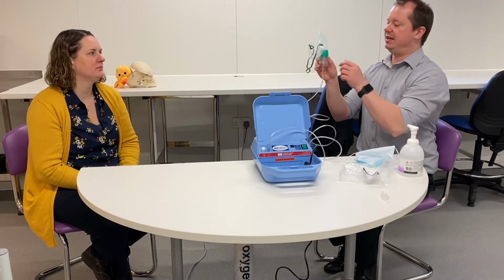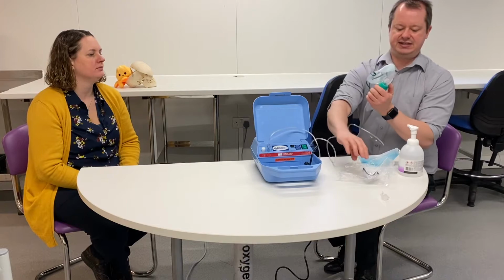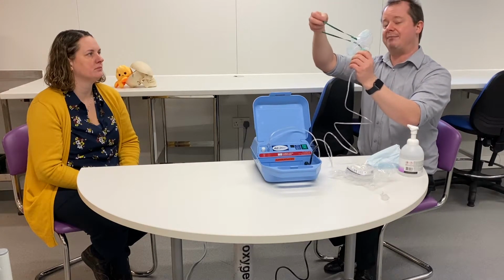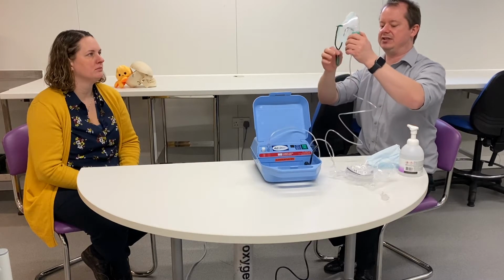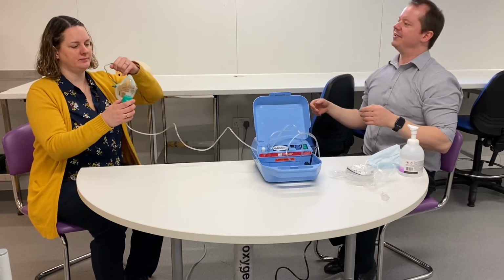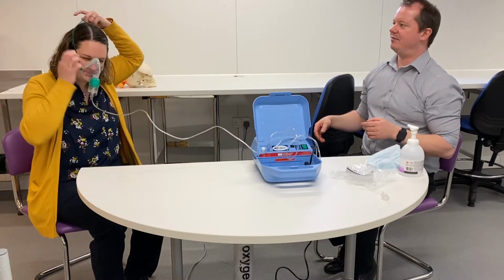Now what we want to do is place this mask on the patient's face. This is a newish kind of mask, so the strap has to go below the ears, so it doesn't make the patient's ears sore. My patient's pretty mobile, Gemma, so she'll be able to put that on herself.